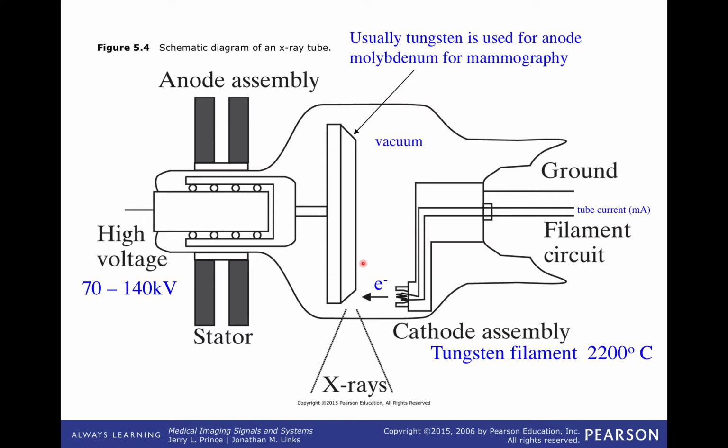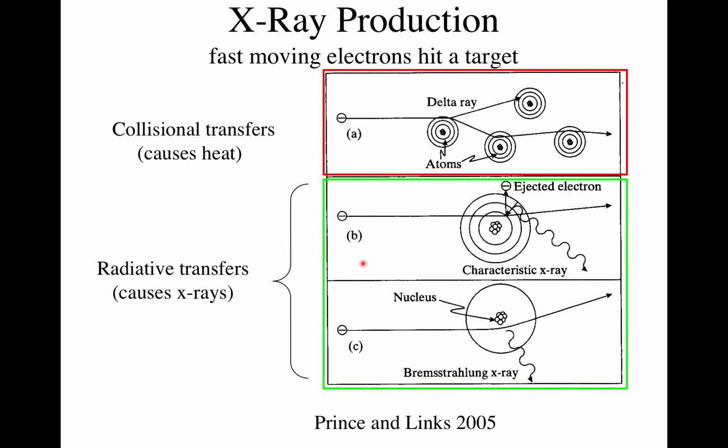So it's like an X-ray light bulb. If you burn it out, it's a big deal. It costs a lot of money. So you don't want to do anything silly. You know, if you basically just image too much on a phantom or something like that, you can cause damage. And so usually there's things in the system that will stop you doing that. And heaven forbid you're doing it when there's a person being imaged, right? So there should be safeties in the system that don't let you put too many X-rays into a person.